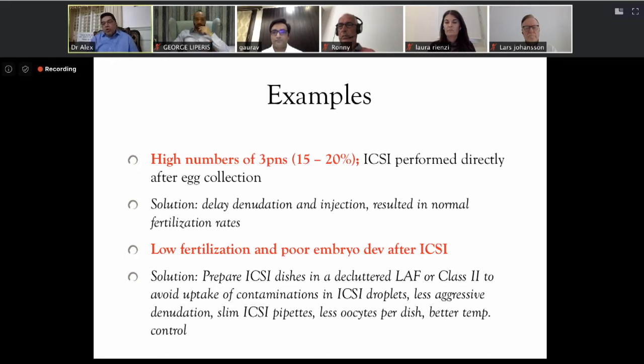In the small incubator with the same locally available CO2, the sperm survival was okay. So then finally, we tried to get good quality gas, both gases, from our vendor, and then it came back to normal.